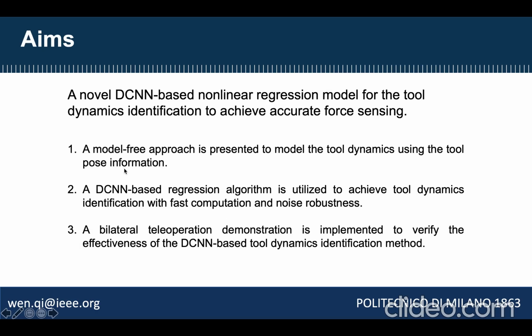In this study, we proposed a novel deep convolutional neural network-based nonlinear regression model, which is a model-free approach. Secondly, the designed DCNN-based regression model aims to achieve fast computation and noise robustness. Lastly, the trained DCNN model is evaluated for online prediction.